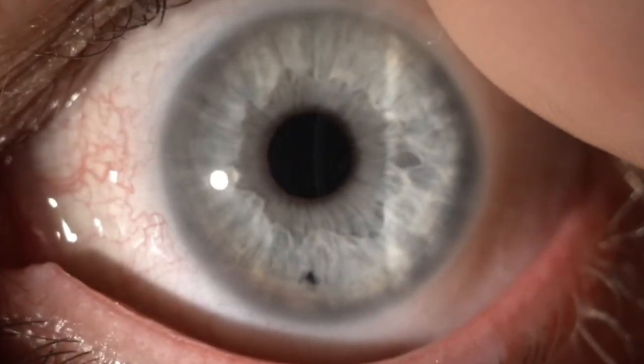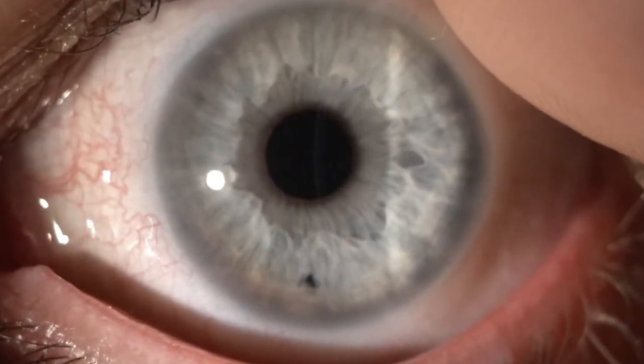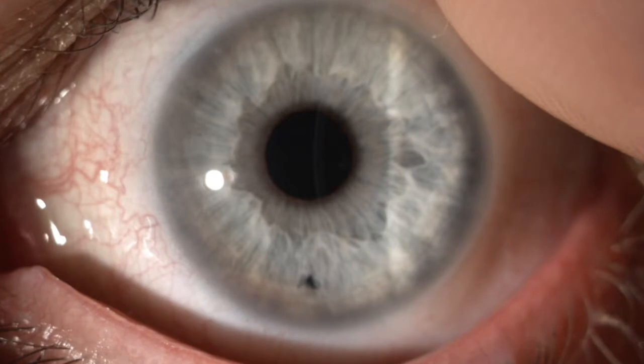Only a few years ago nobody would think that this patient underwent a keratoplasty procedure for his cornea guttata only two weeks ago. Now he can see 20/20 uncorrected in the absence of any suture and we know that Descemet membrane endothelial keratoplasty can yield this kind of outcomes.